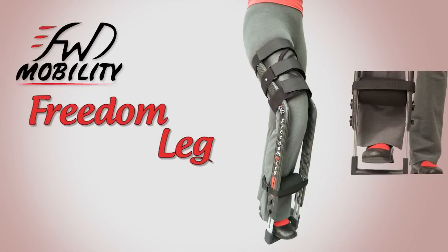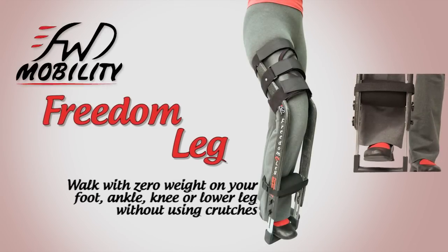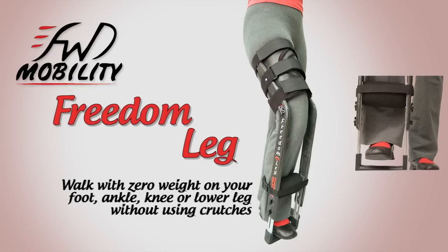One of our most exciting products is the Freedom Leg Brace. It allows you to walk with zero weight on an injured knee, foot or ankle without using crutches.